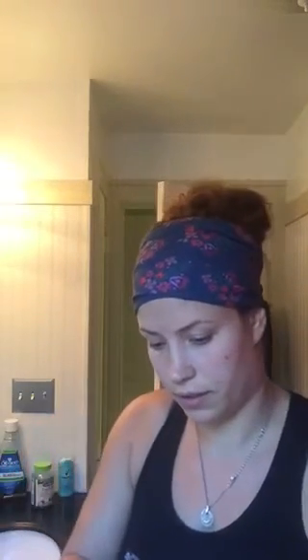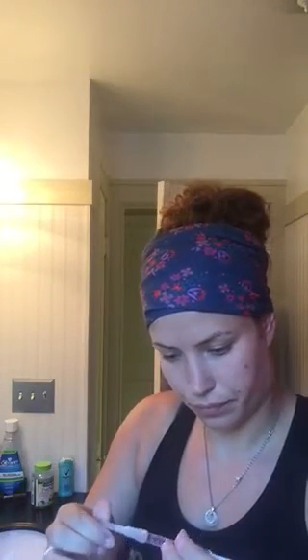The other needles that I was using for the Menopur and Gonal F were 27 gauge needles, 1/2 inch in length. These are 27 gauge needles, 3/4 inch in length. So they're just a little bit longer, but they're not any bigger. They don't really hurt, maybe a little bit more of a pinch. It's not a big deal at all. So take the top off of that needle. If you can see that there, just a little bit longer.